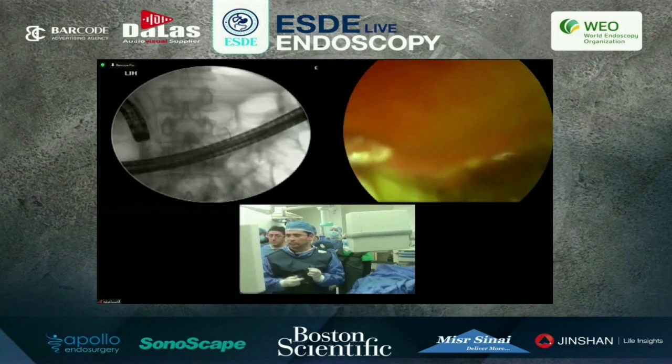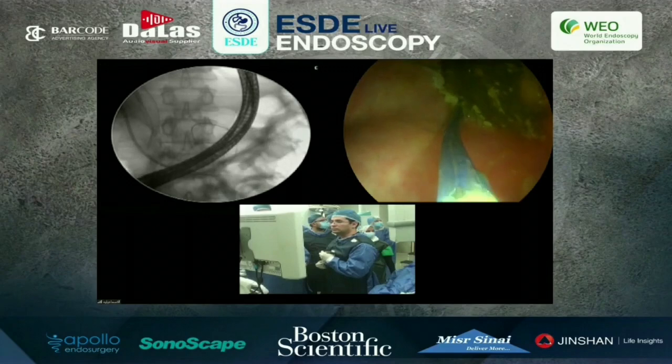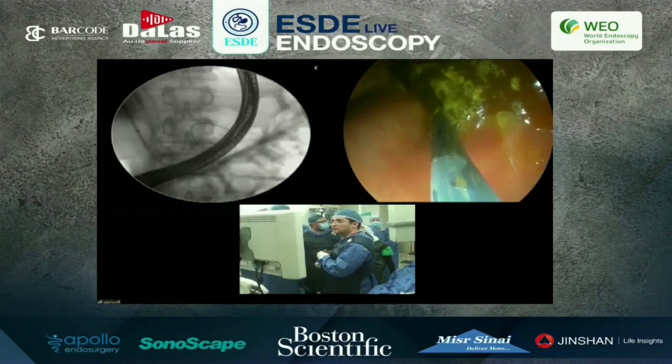Professor Gamal, are you going to introduce your stent? Yes, the stent we will introduce now. What size stent is this? A 9 centimeter or a 12 centimeter? 12 centimeter. Sorry.